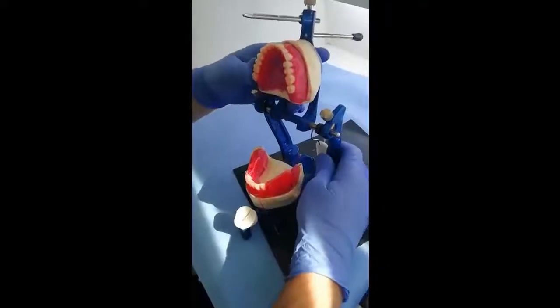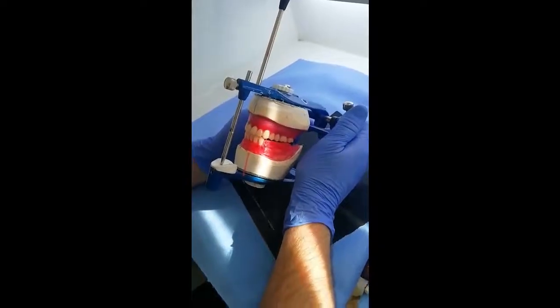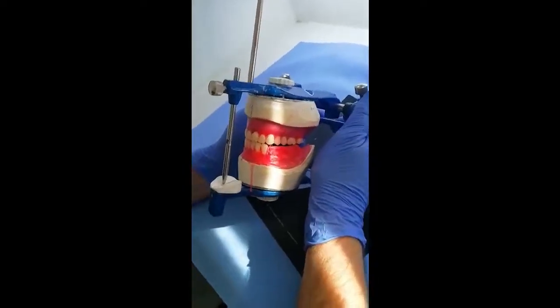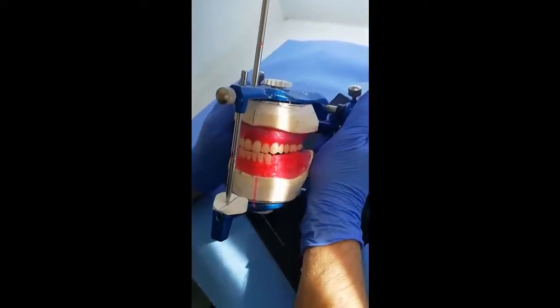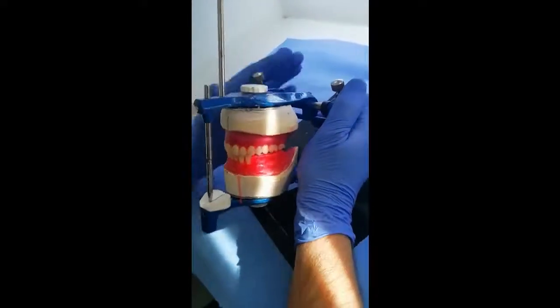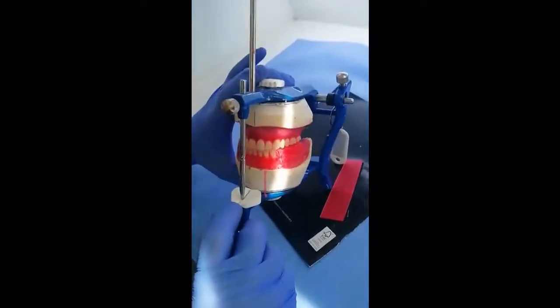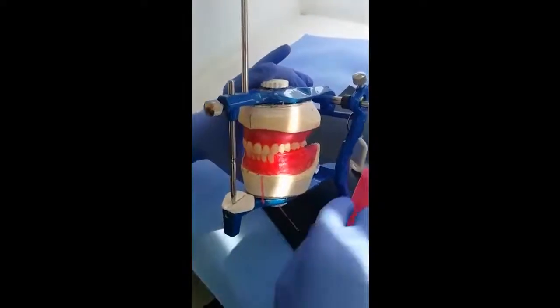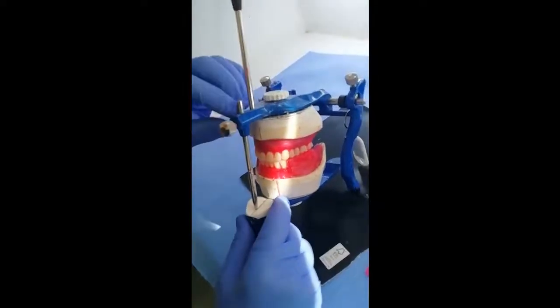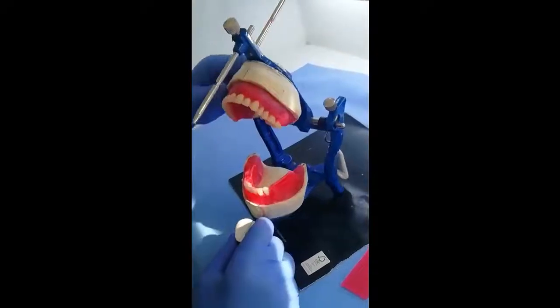Now, we already finished the arrangement of mandibular anterior teeth, and you can see that we can achieve edge to edge and tip to tip in lateral and protrusive movement without the separation of the pin from the incisal guidance table, and we have the zero line as we determined the vertical dimension of occlusion.